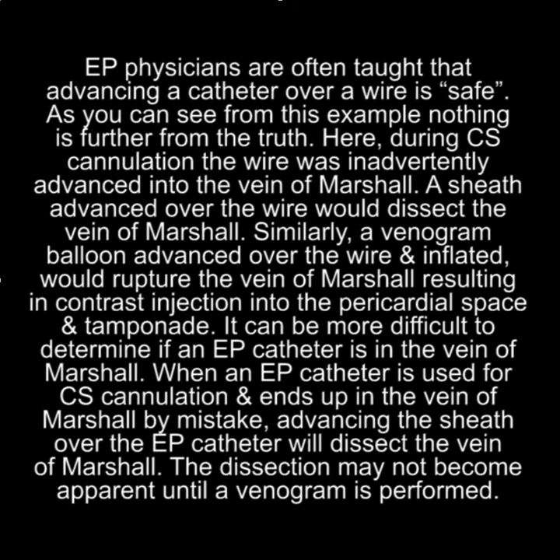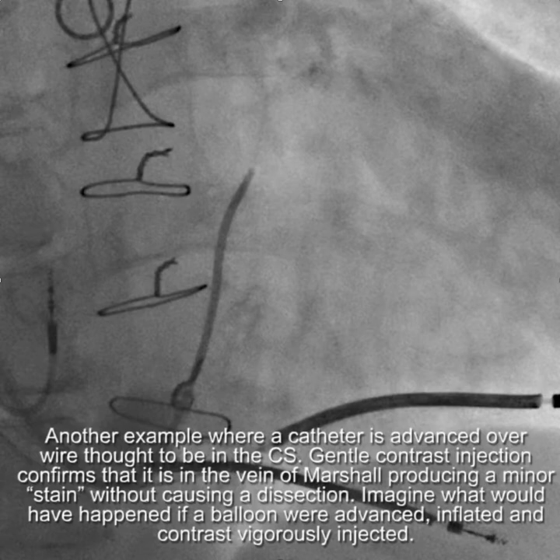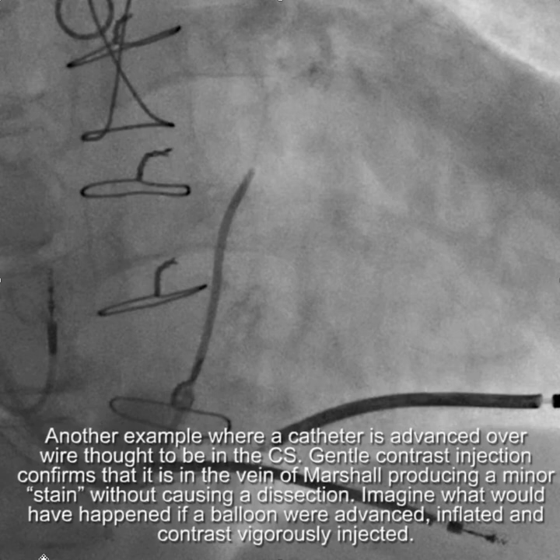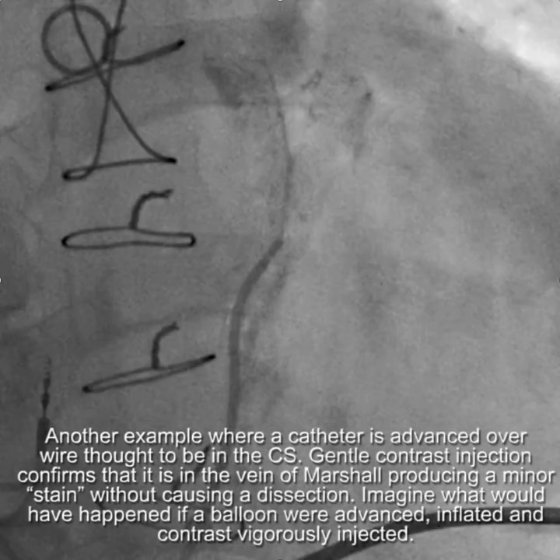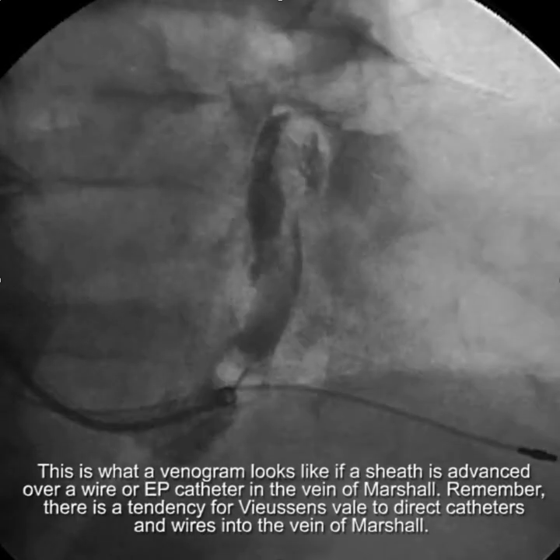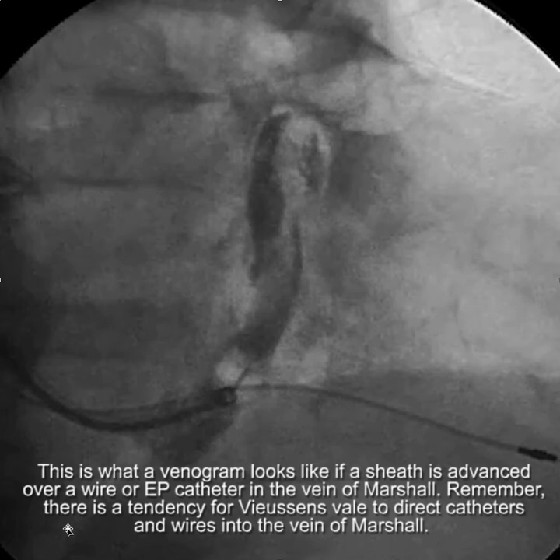This dissection probably won't become apparent until you do a venogram. Here is another example where a catheter is advanced over a wire thought to be in the CS. Gentle contrast injection confirms that it is in the vein of Marshall, producing a minor stain without causing a dissection. Just imagine what would happen if a balloon were advanced, inflated, and contrast were vigorously injected. This is what a venogram looks like if a sheath is advanced over a wire or EP catheter into the vein of Marshall, again thinking that it's safe.